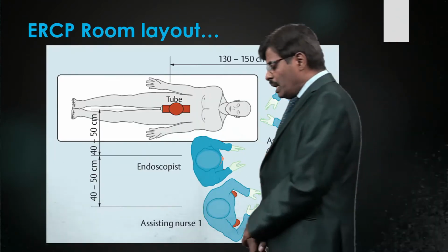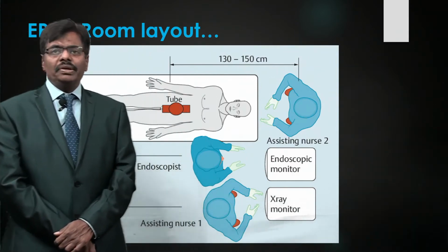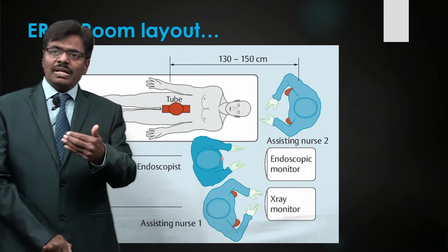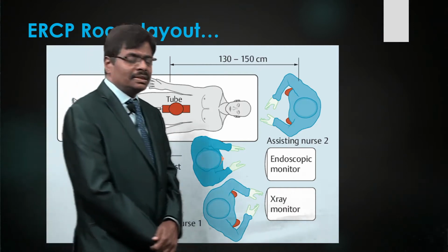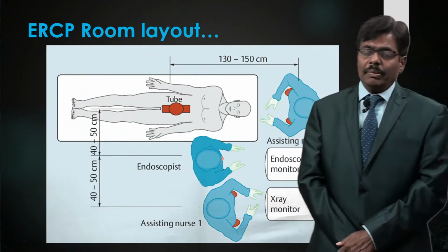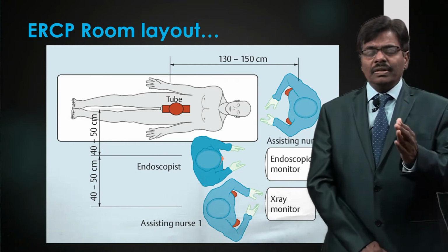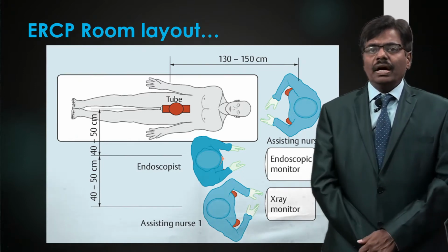And this is the room layout. Just roughly to say, imagine the patient ideally in a supine or prone or left lateral position, whichever, on a radiolucent table. The assistant nurse, it says here, is actually my anesthetist, who normally stays there because I do it mostly under GA. And the endoscopist is myself, my staff nurse on the right is my right hand, she will have her trolley.